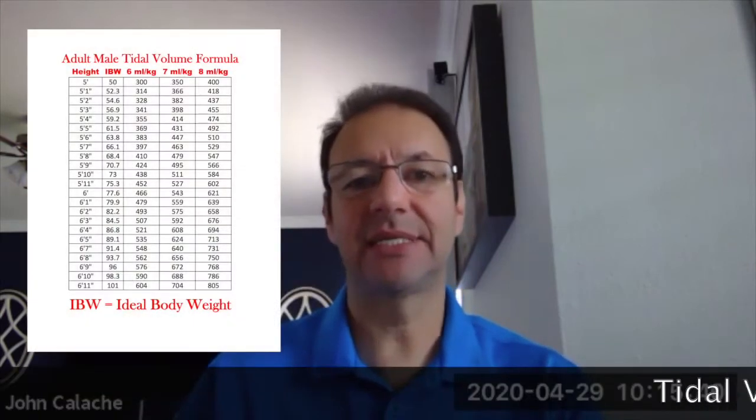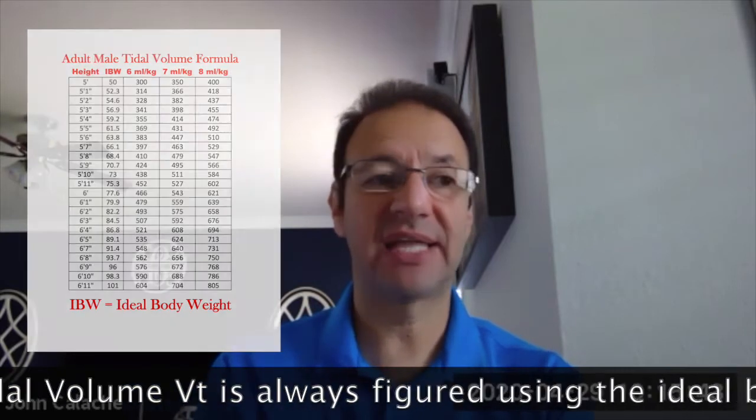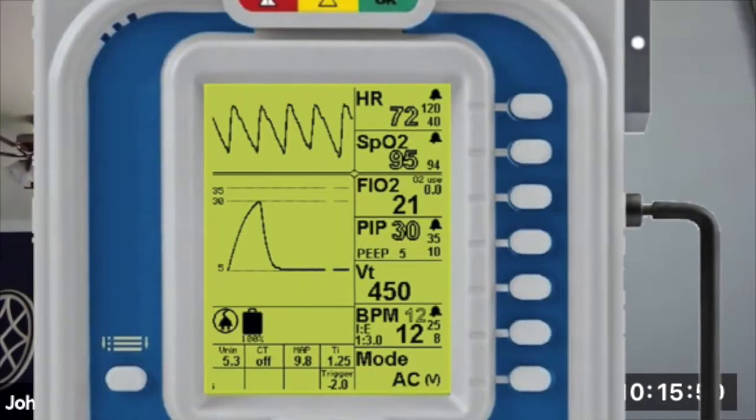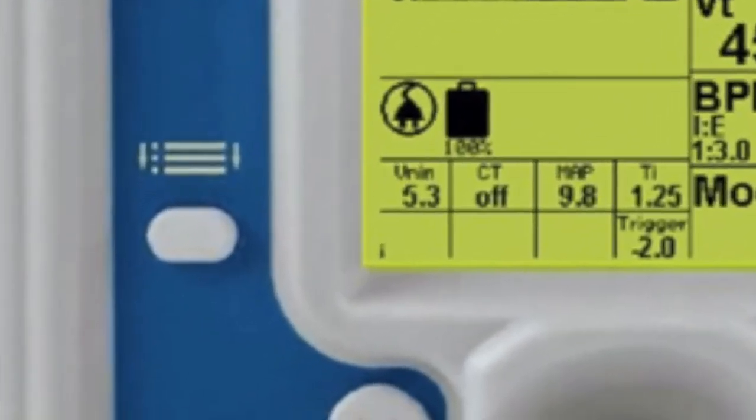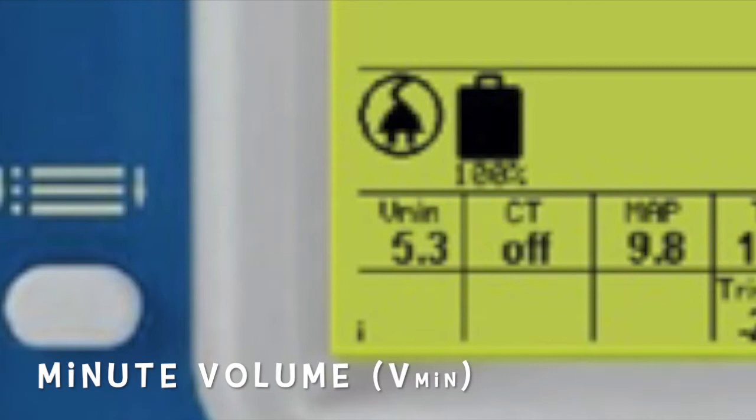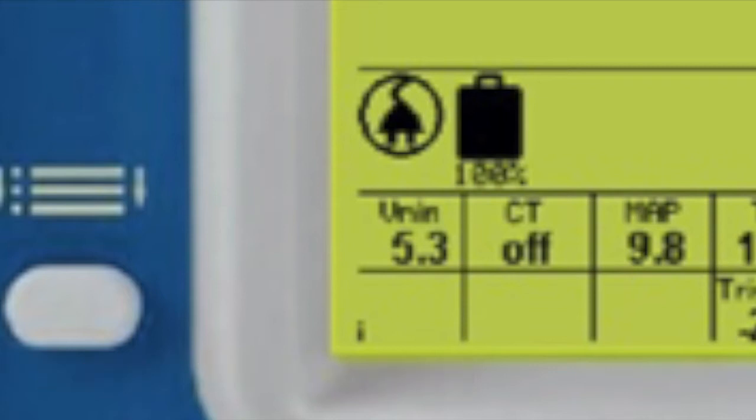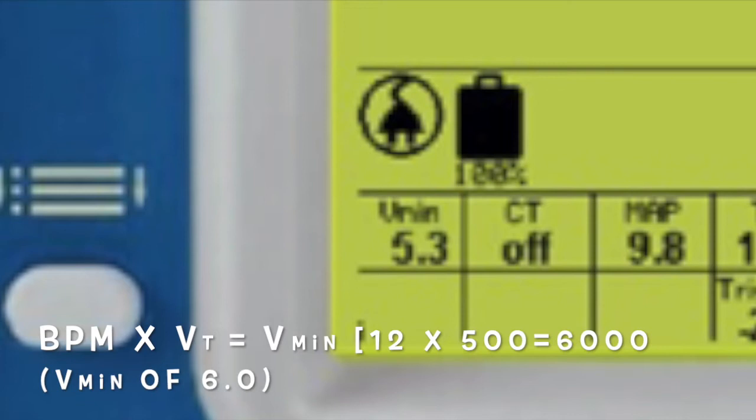We can't control how many breaths they take on their own; we can only control the backup rate, so we set it to 12 breaths a minute. We set the tidal volume to 500cc's — your medical director may have a chart based on ideal body weight, so follow your protocol. But if you're doing 500cc's of tidal volume, you're basing your minute volume — which is rate times tidal volume — on 12 breaths per minute times 500cc's, meaning that patient's minute volume should be around 6,000cc's.